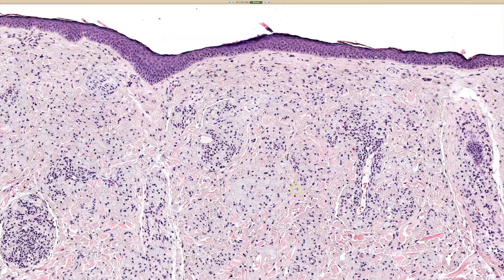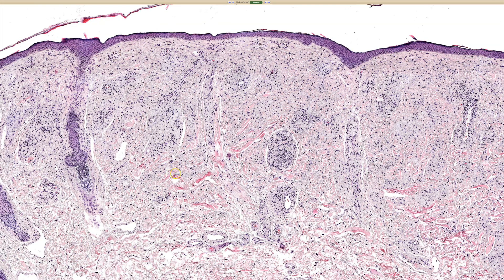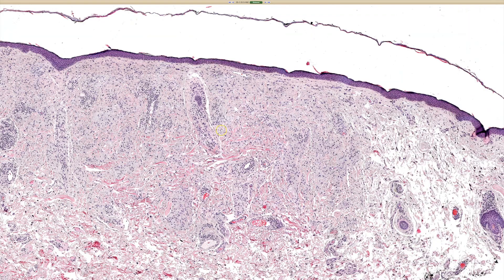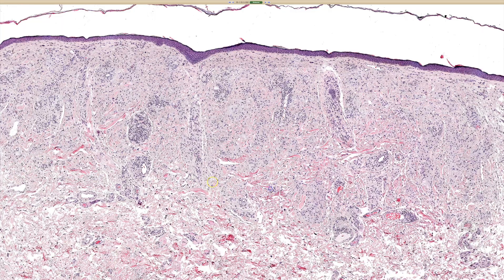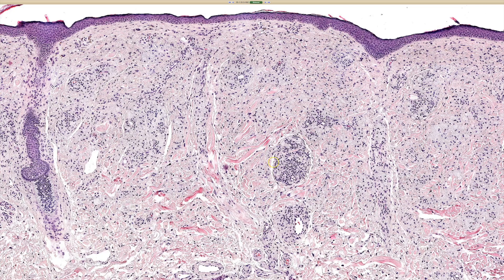From low power, xanthelasma doesn't look very exciting because the cells are kind of pale and their cytoplasm blends into the background. But when you go closer, they really are a bunch of histiocytes trickling in between the collagen. They generally preserve the dermal structures — they just fill the spaces in between and don't really destroy or push out of the way any normal structures. There may be a little lymphocytic inflammation, but in general xanthelasma is usually almost purely foamy histiocytes with very minimal inflammation or fibrosis.